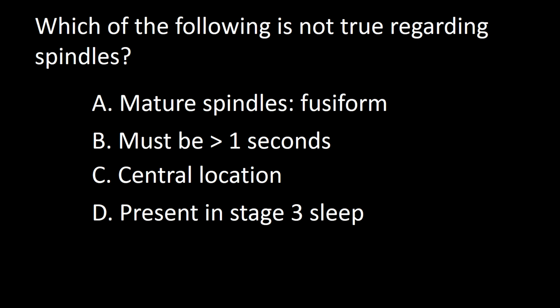Next question. Which of the following is not true regarding spindles? A. Mature spindles are fusiform. B. Must be more than 1 second. C. Central location. D. Present in stage 3 sleep.